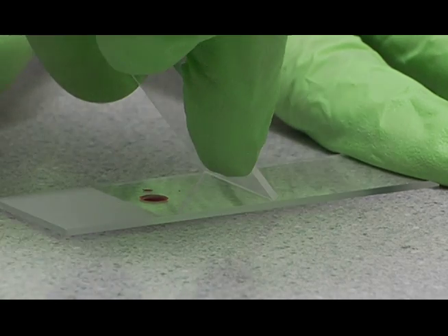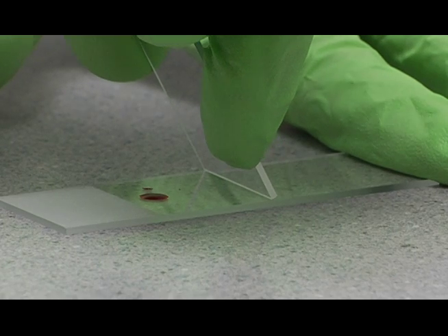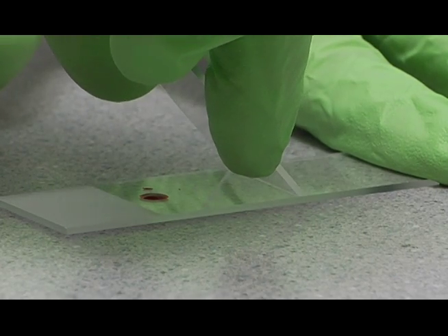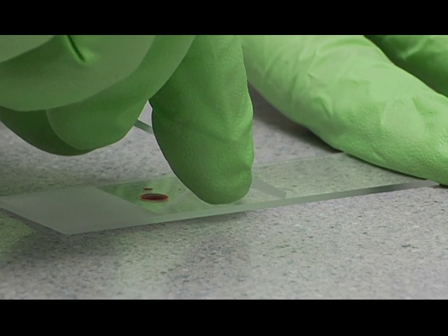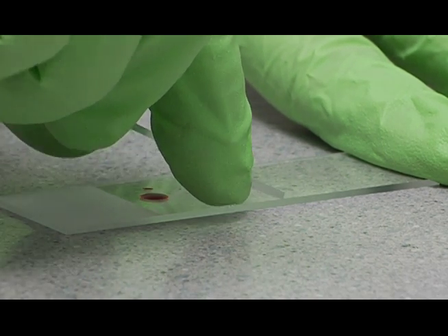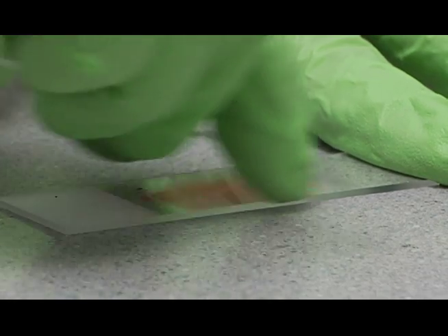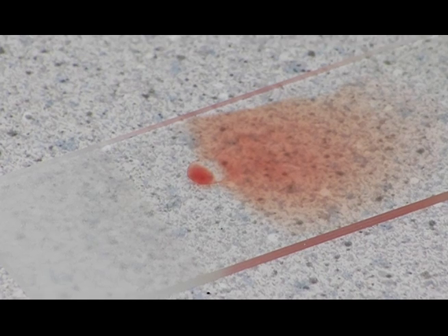Now your first slide was a little too thin. You can make it thicker by increasing the angle like this. If it was too thick, you can make it thinner by decreasing the angle like this. Then you back up to the drop, let it spread, and go forward.